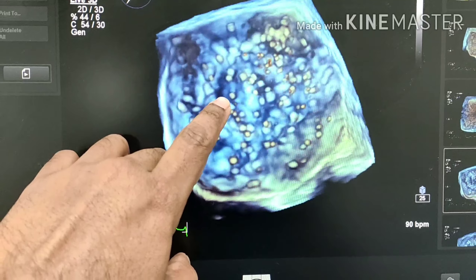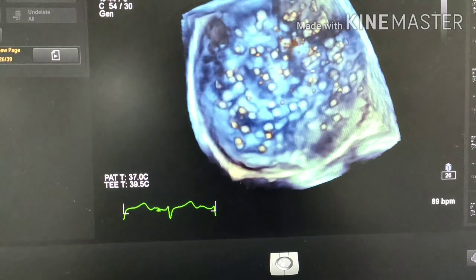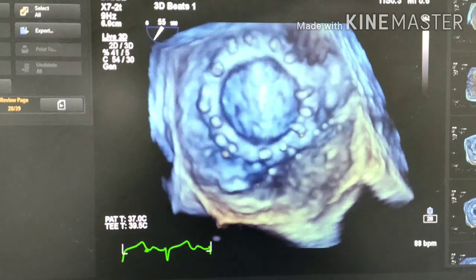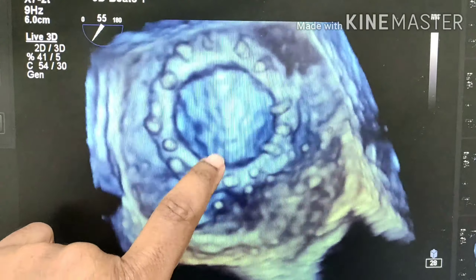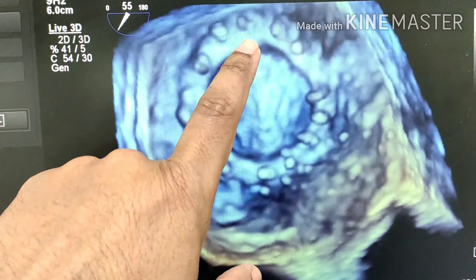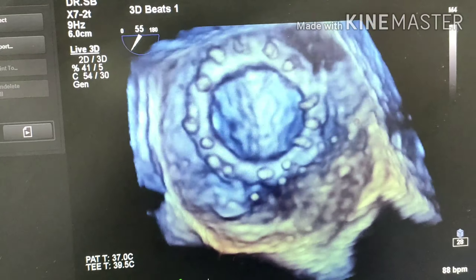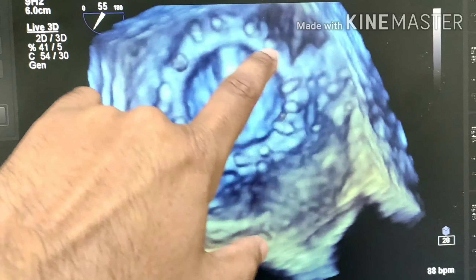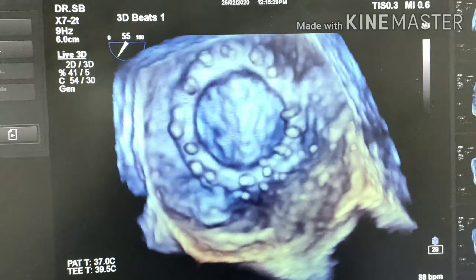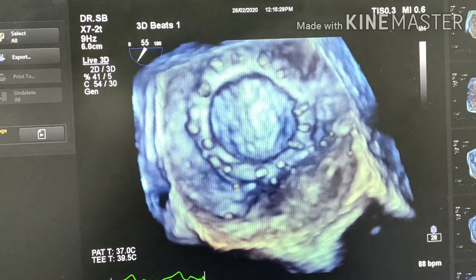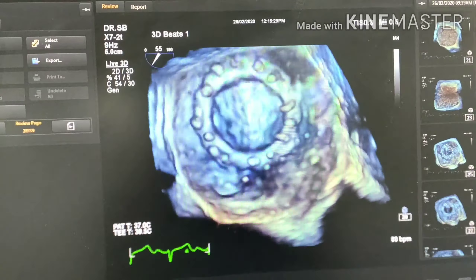As the air clears, you can see the valve. Eventually what you see are two semicircular leaflets — these are the two major orifice areas — and in between them the smaller parallel zone, which is the minor orifice area. This is the sewing cuff, and you can see the sutures very nicely on the valve. This is the floor of the left atrium. This is the en-face or surgical view — a beautiful picture of the mechanical bileaflet mitral valve in position, working optimally.